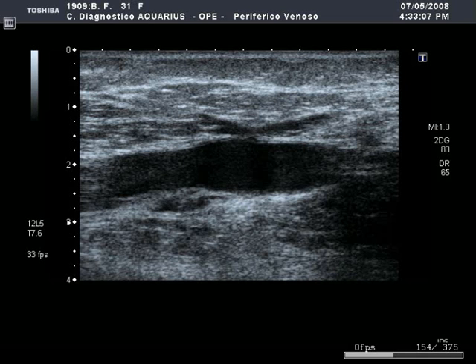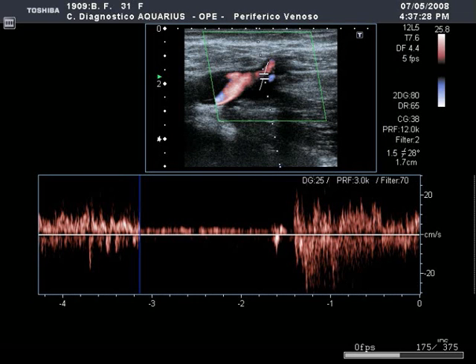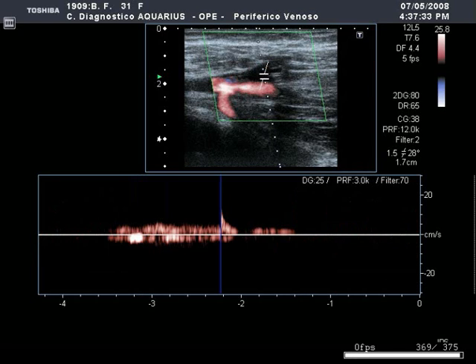A longitudinal section of the saphenofemoral junction showed the valves, from left to right: ilio-femoral, epigastric, saphenofemoral junction terminal and preterminal ones. The exam here detailed was not perfect. The sample volume was correctly positioned at the level of the saphenofemoral terminal valve, but not exactly over the flow. In the registration at the iliac level instead, the angle direction was not along the flow.